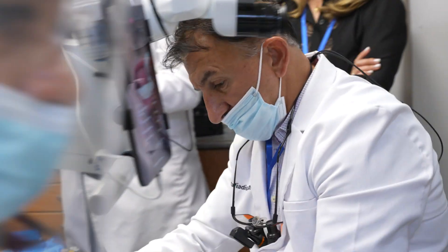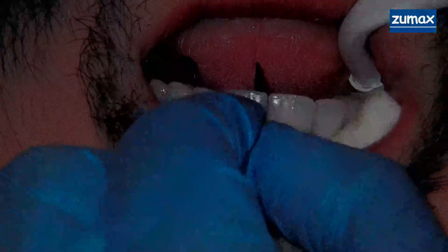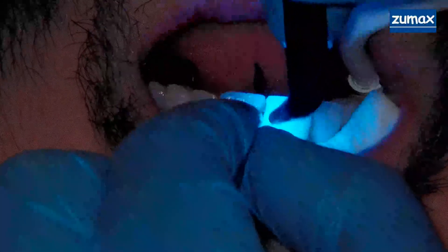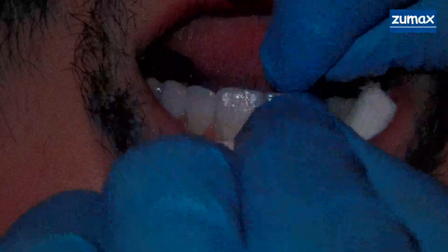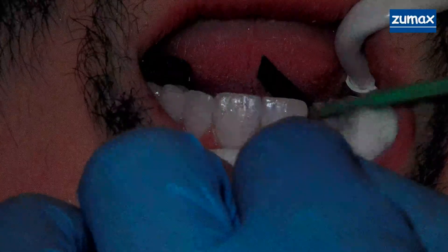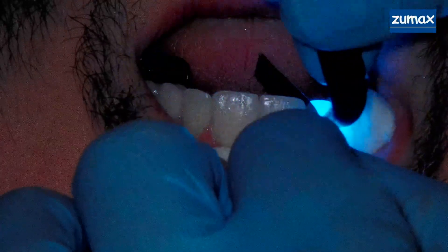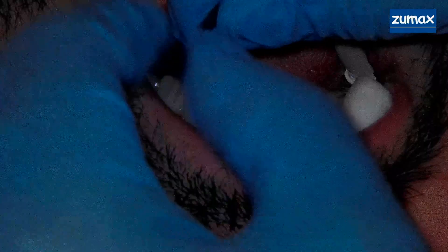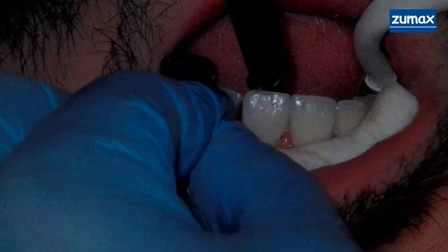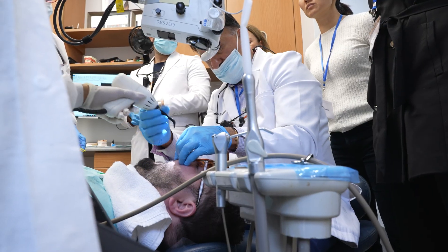Tori's tacking on the right, tacking on the left, tacking on the right. I pull out towards the lingual, go in towards the lingual, wipe a little bit. Tack distal. Tack mesial. Pull out from the lingual on this side. Wipe — a little excess there. And we go.